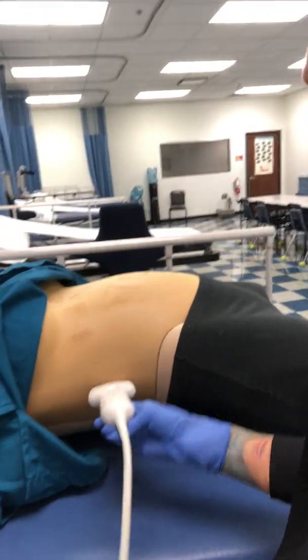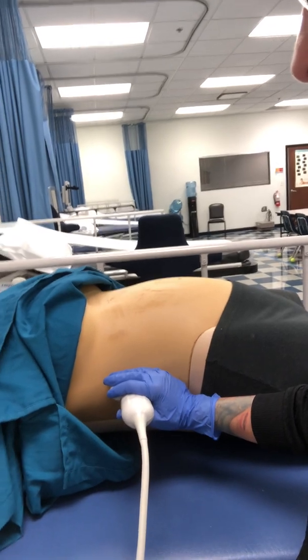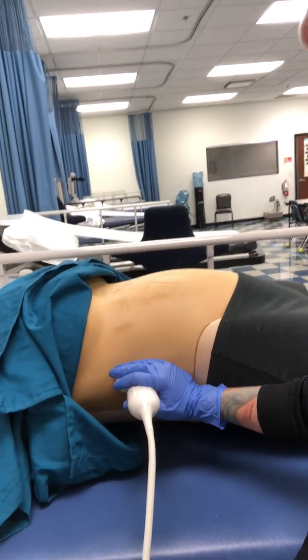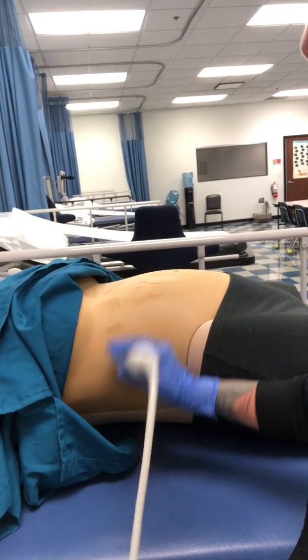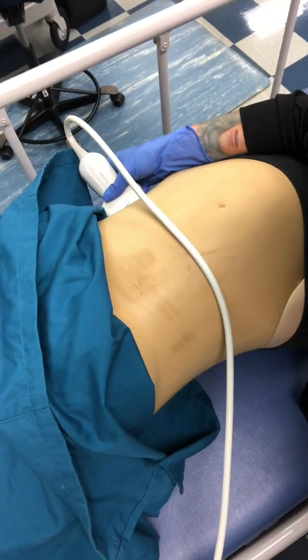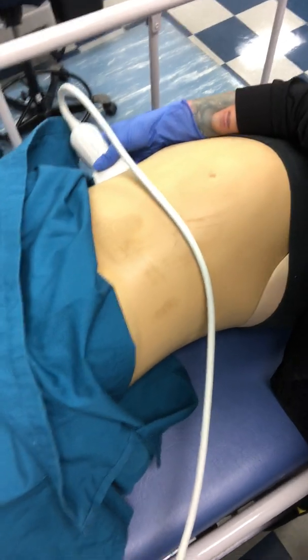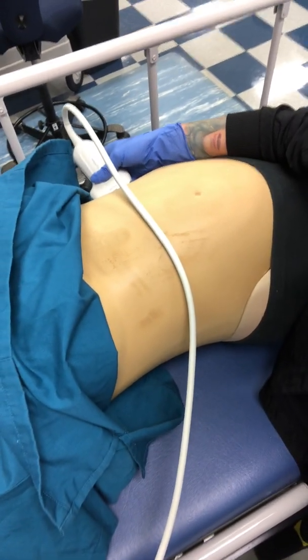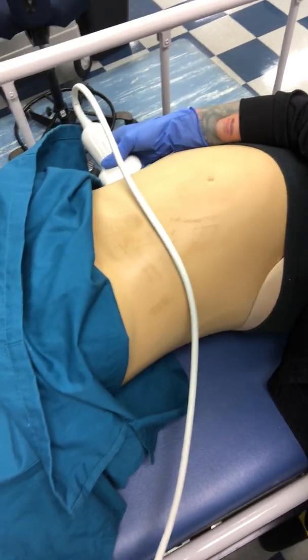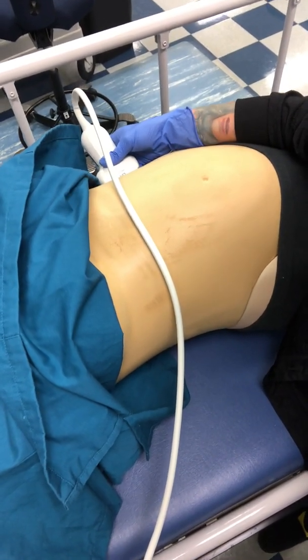Again, if we're looking at our probe, we're going from the patient's right lateral aspect and scanning towards the medial portion. And then if we move to the opposite side, we are scanning from the patient's now left side, so it would be left lateral towards the medial aspect of the patient. Because again, we really can't go any more lateral than this. So if you are going lateral, you're going to have to scan medially.